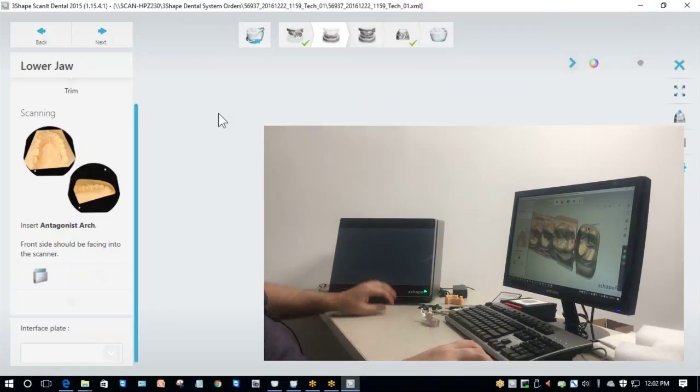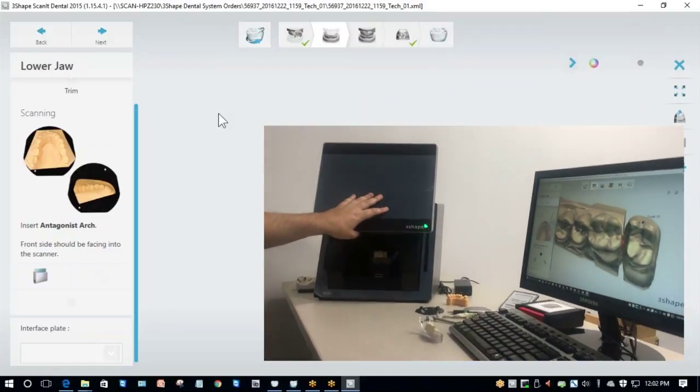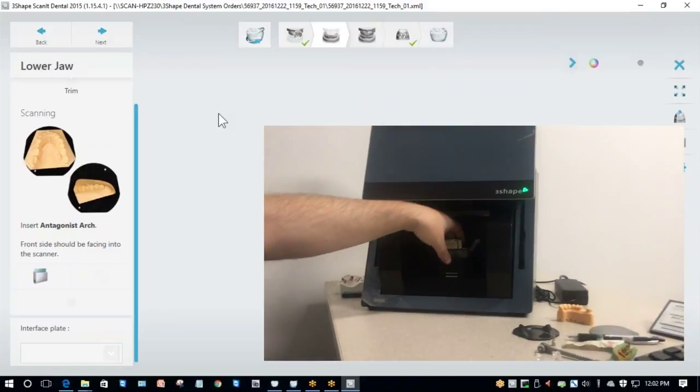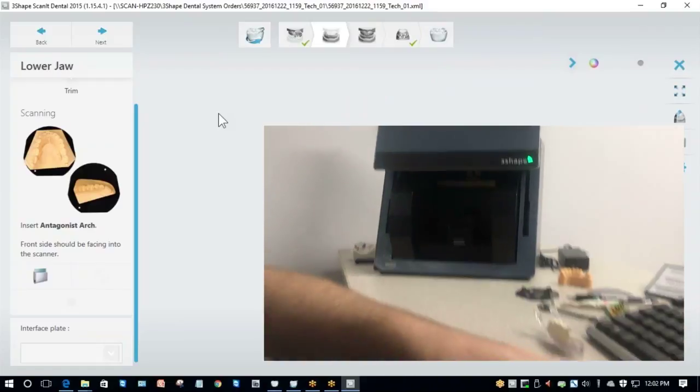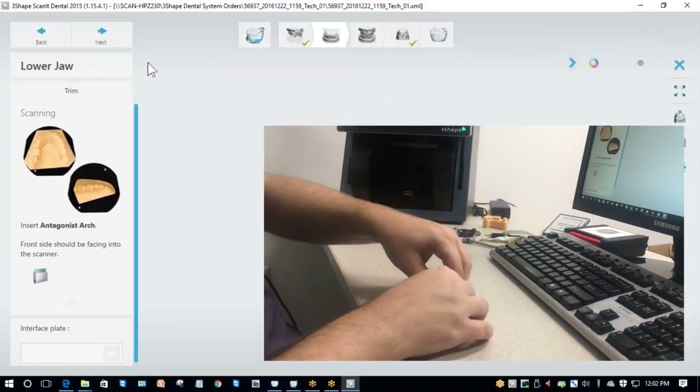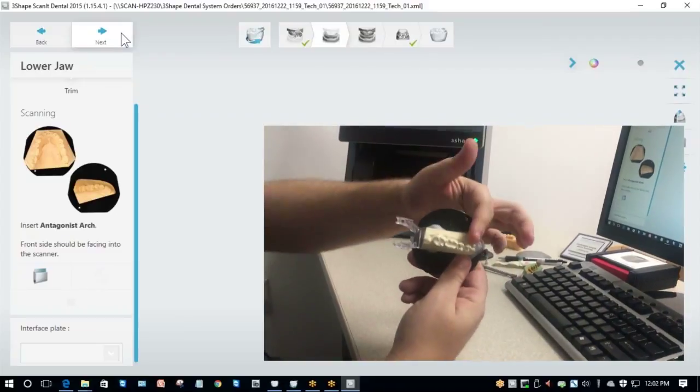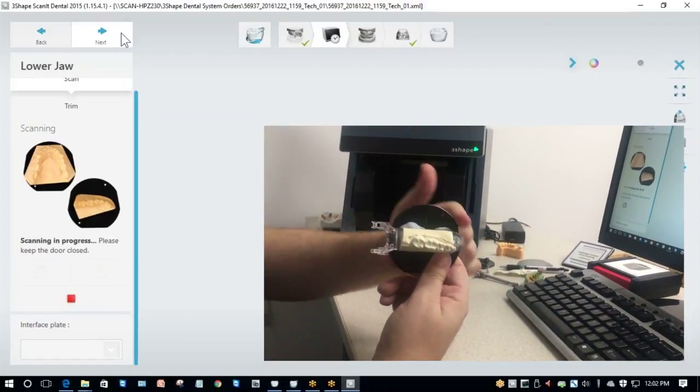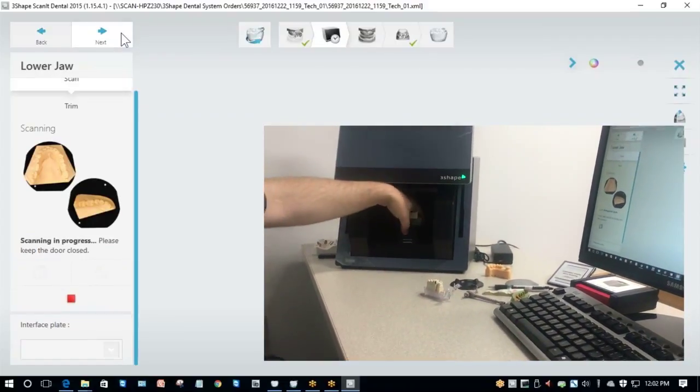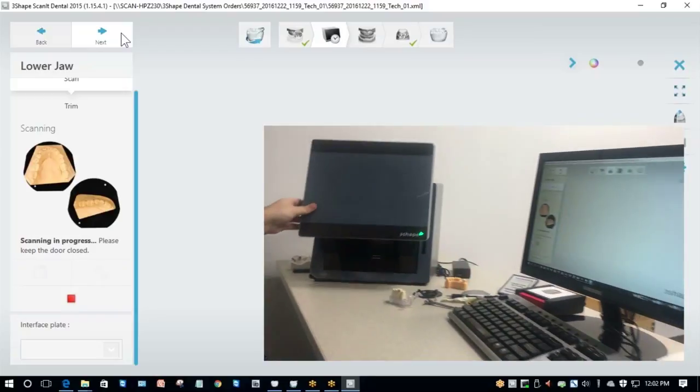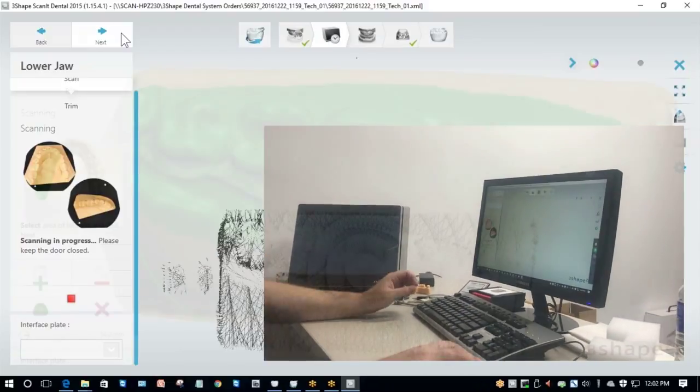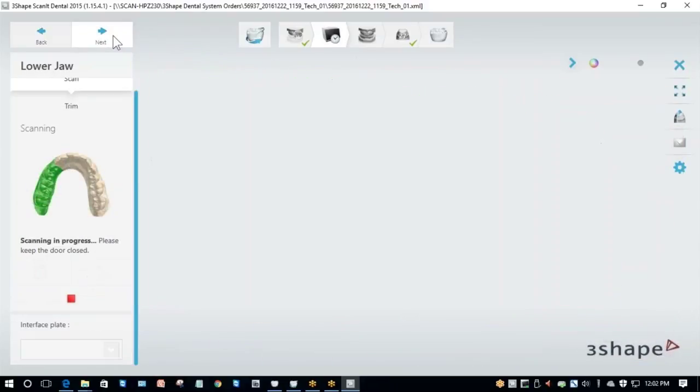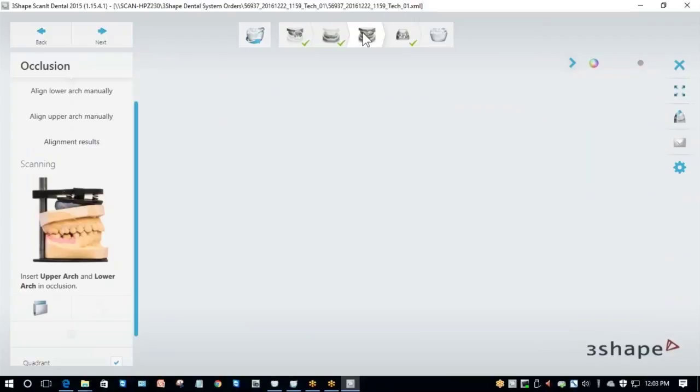Now I need to put my antagonist arch on the model. Again, make sure you're putting it buccal side to the round side of the plate, lingual side to the flat side. Once I've got it in the scanner, I close the door, click Next, and it does another preview scan. Once it's done with the preview scan, I once again highlight the area that I want to keep and hit Next. Now it's completed the final scan of my opposing model.